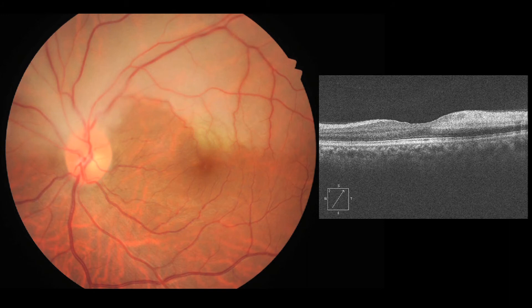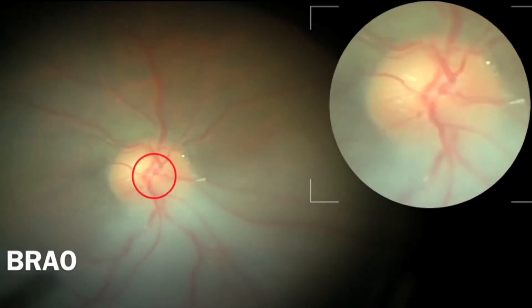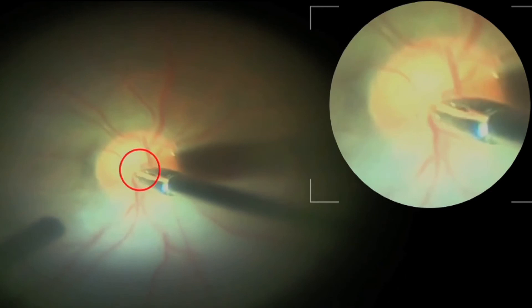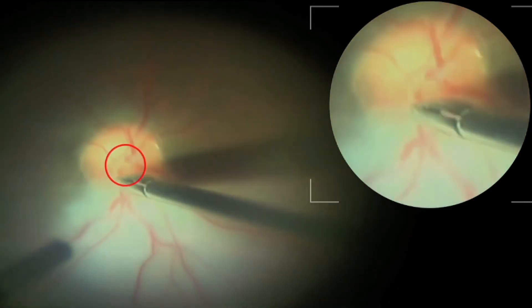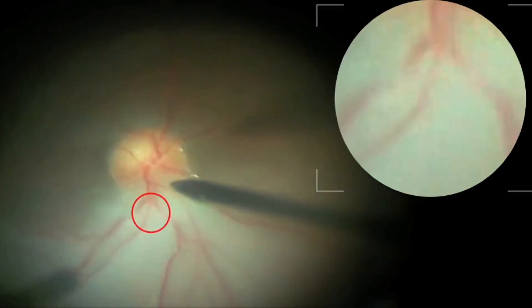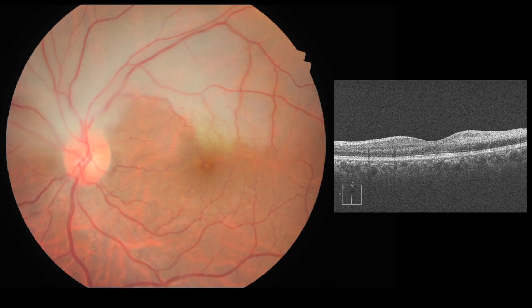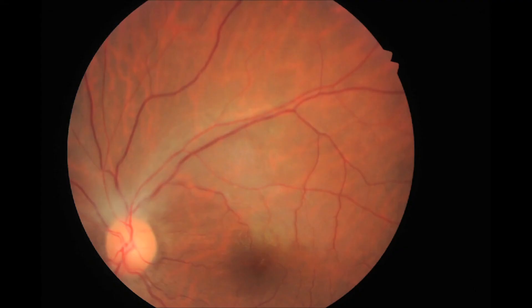In another case of branch retinal artery occlusion having progressive visual loss, a low IOP vitrectomy was performed. The disc was dissected at the site of the occlusion. After direct massage of the artery, the thrombus can be seen migrating to the periphery. This eye recovered very well, with vision improving to 6/6 by the 5th post-operative day.